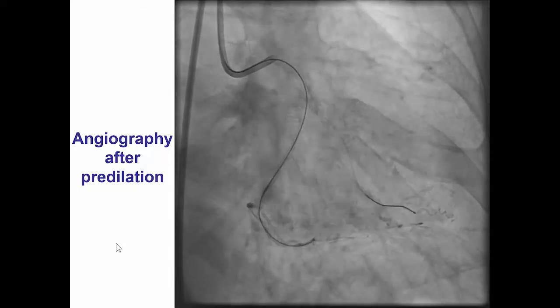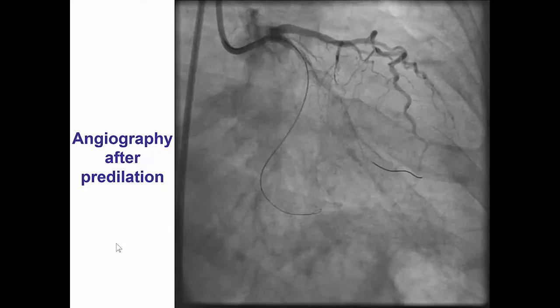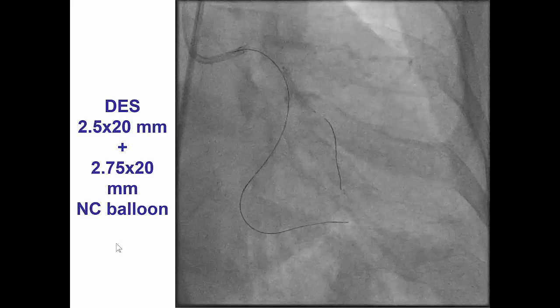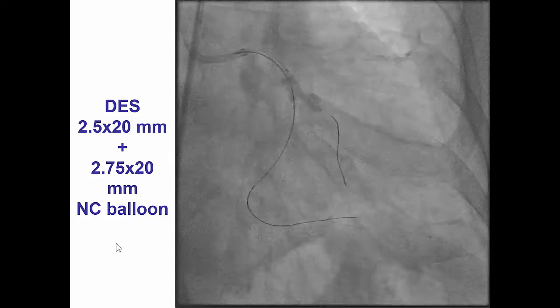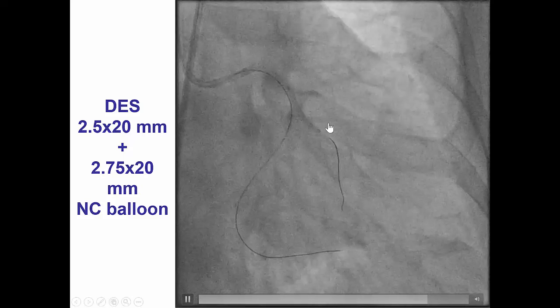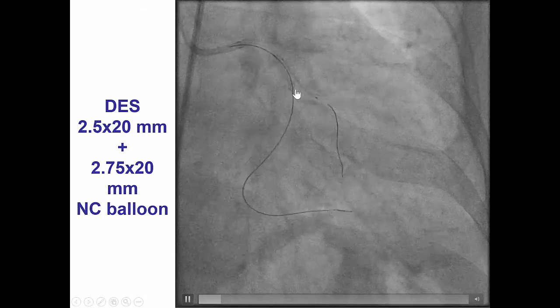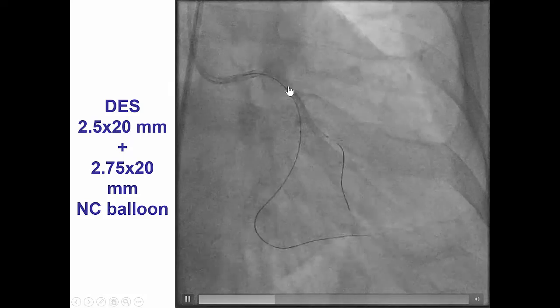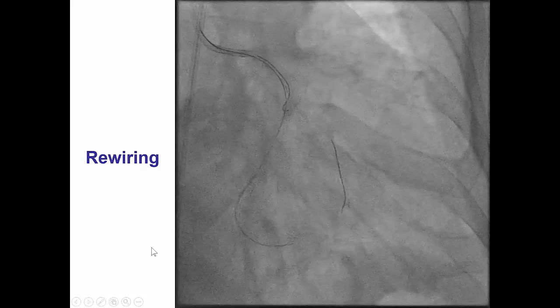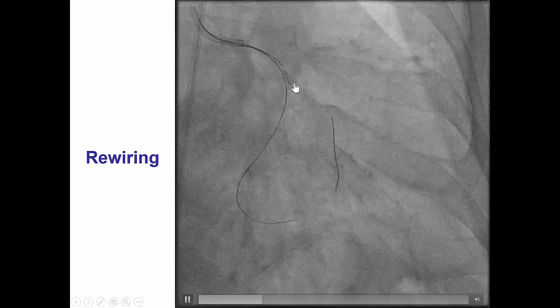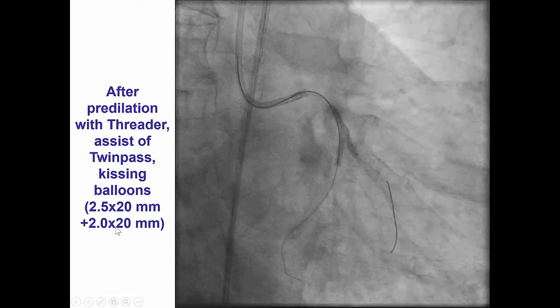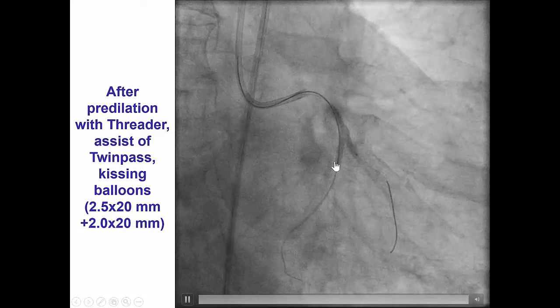At this point, we thought that we had distal true lumen entry into both branches, and given that both branches were large, our plan was to perform a two-stent technique with a DK crush. A 2.5 by 20 millimeter stent was placed into the first obtuse marginal, and then was crushed with a 2.75 non-compliant balloon. The OM was successfully rewired with another wire, followed by kissing balloon inflation.